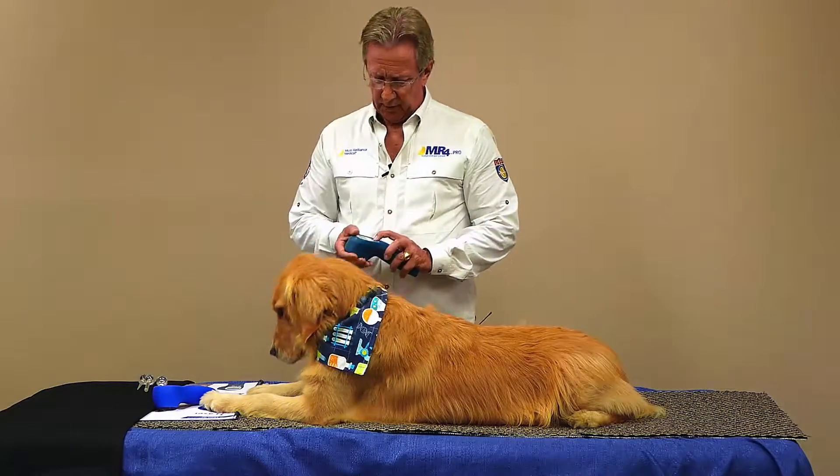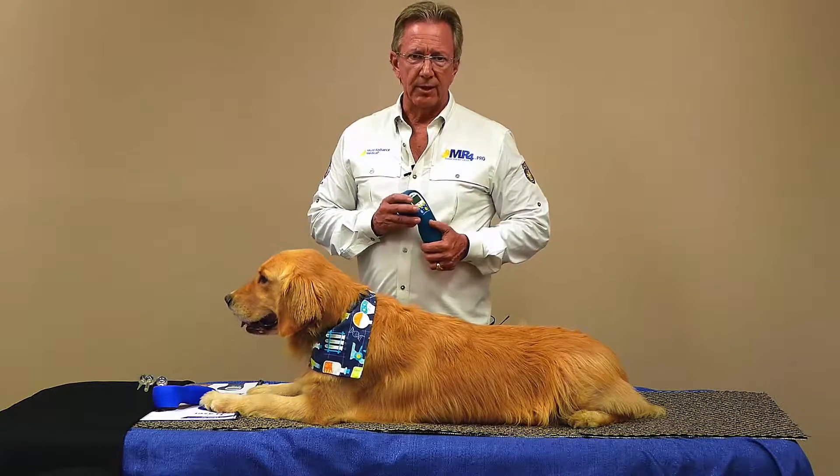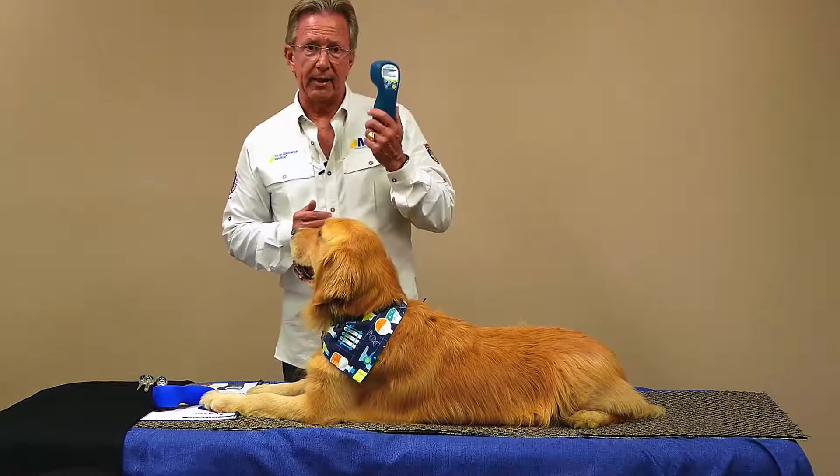This blue is really starting to catch on. There are even robots going into hospital rooms where they've had terrible problems with MRSA, and the robot just goes in and paints the entire room with blue laser light to kill those bacteria. And now you can do that with the Activette Pro.